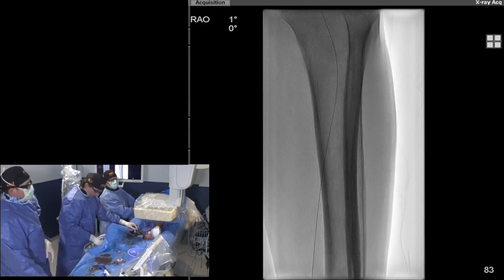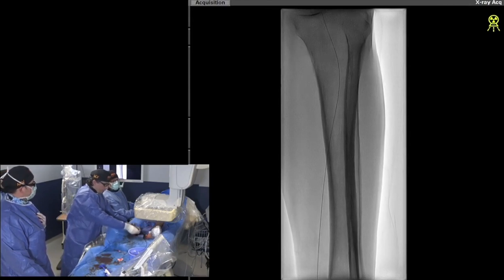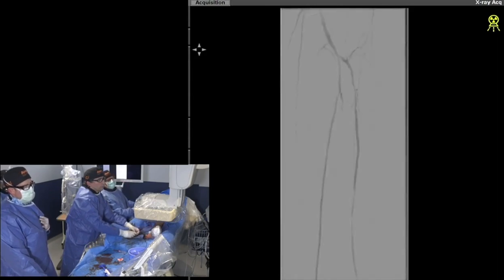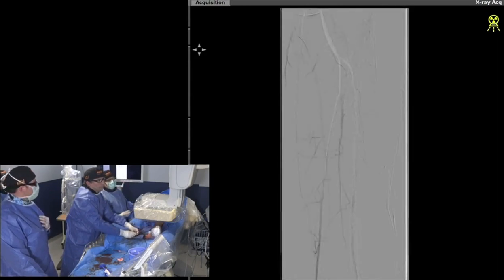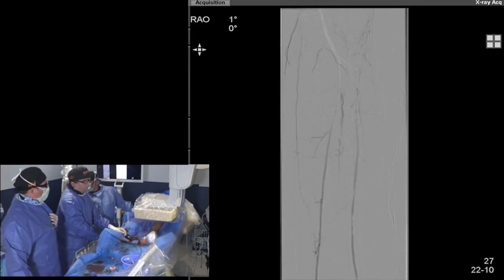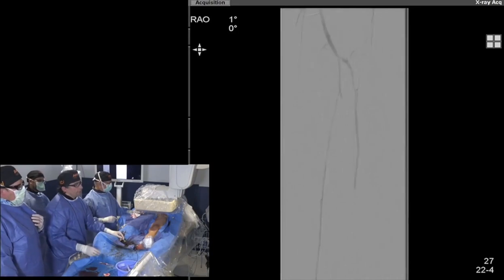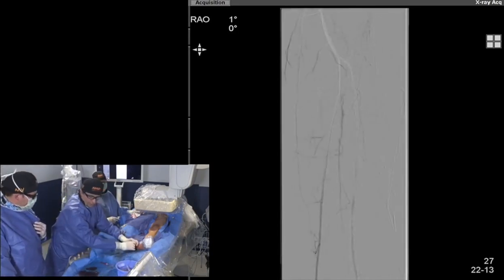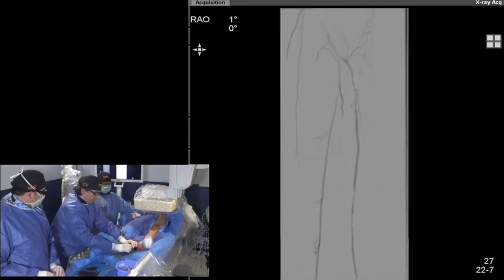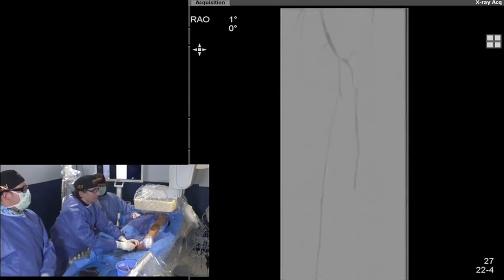Let me show you the runoff. Let's inject — awesome, that looks great! So if we're going to stent, just cover that recoiled area all the way to the CTO cap. I think we're going to go ahead and do that. No we have time — how long does it take to put a stent? Give him a 6 x 200 stent and let's go!